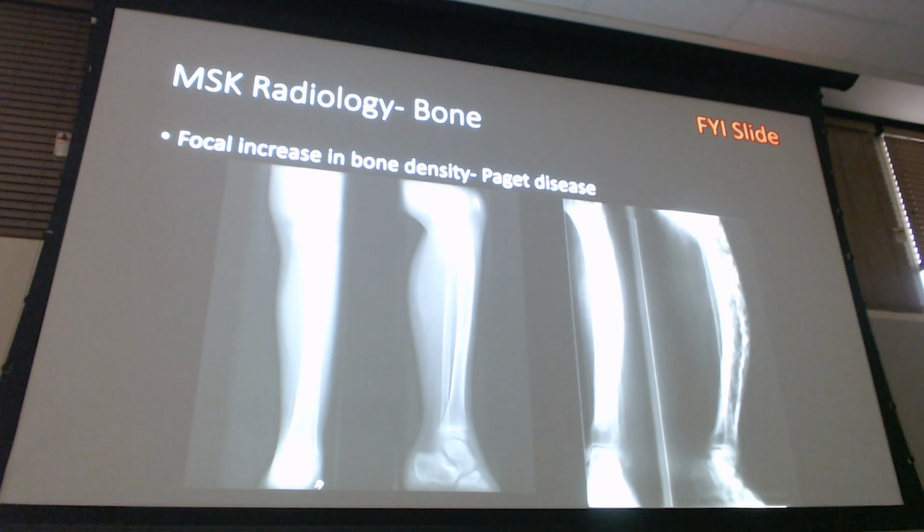There's not many things that look like this that aren't Paget's. You will see this more in pediatrics. Now, how do I know this is a pediatric X-ray? We haven't covered this yet. Anybody know? Use the normal X-ray to look at it, not the abnormal.